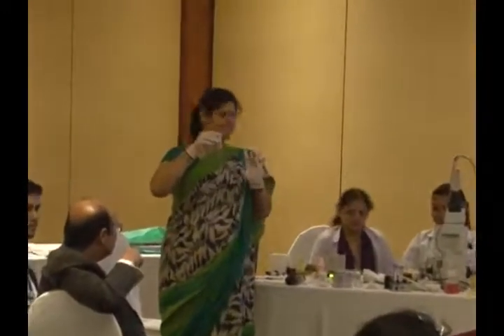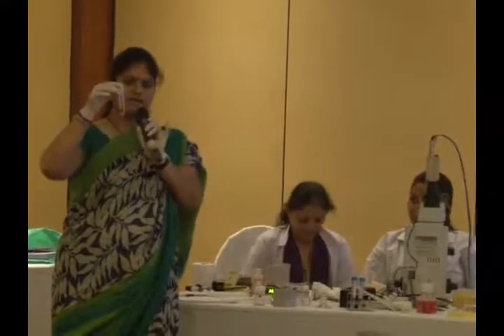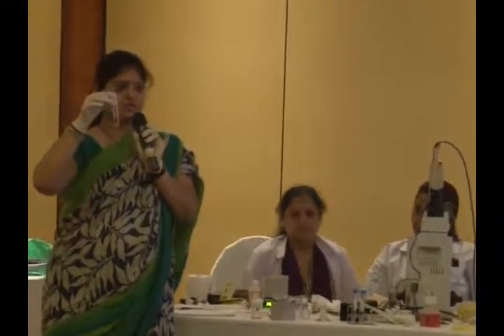Now this tube will go at 37 degrees temperature for 45 minutes to 1 hour.